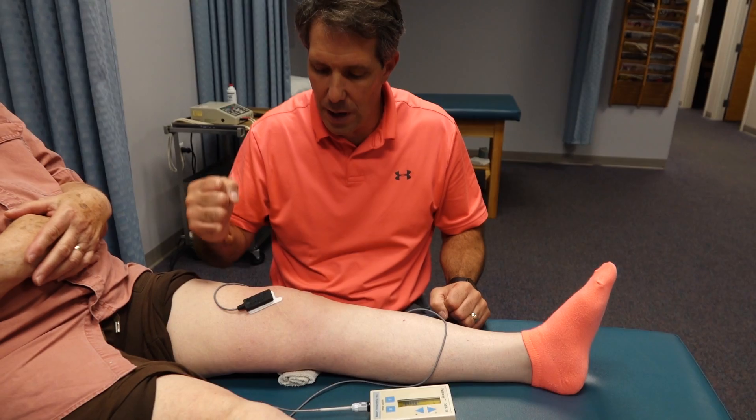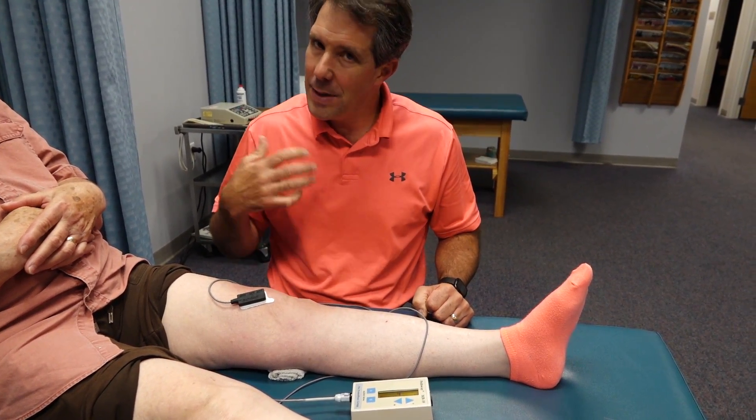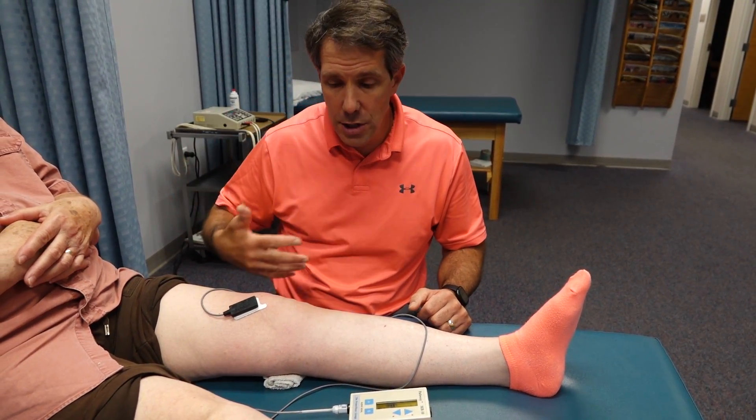Now push really hard, try to make it beep. Push hard. Now it's getting to be a little more challenging. As she learns and develops a little bit more neuromuscular control, she'll be able to tighten it better.